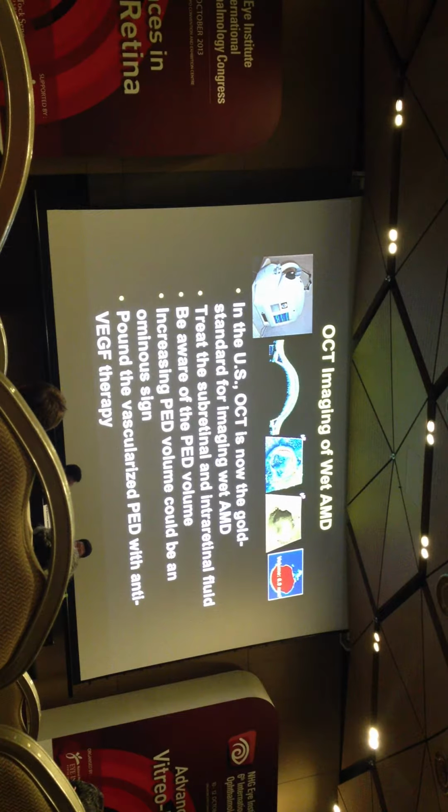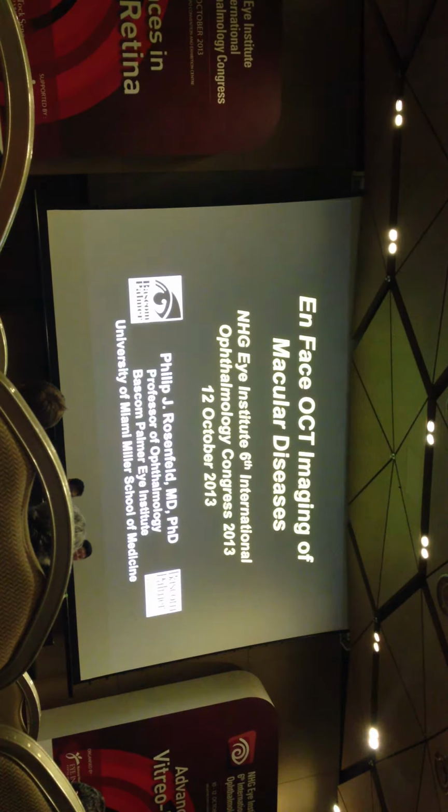Okay. En-face OCT imaging. Hopefully the algorithms will be developed with the swept source OCT so we can do the exact same thing. Unfortunately, you just can't take the same algorithms and apply them to the swept source database as with the Cirrus type. It requires some alterations. So en-face imaging.